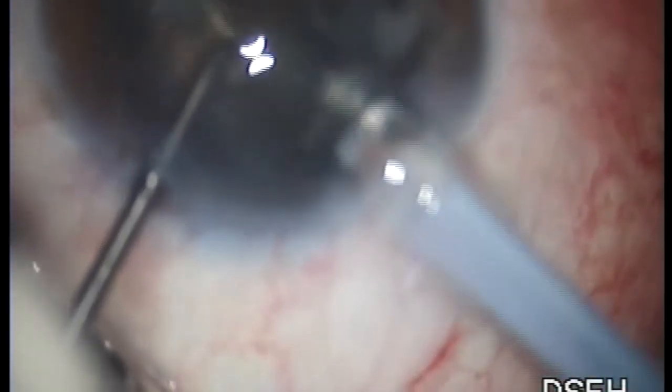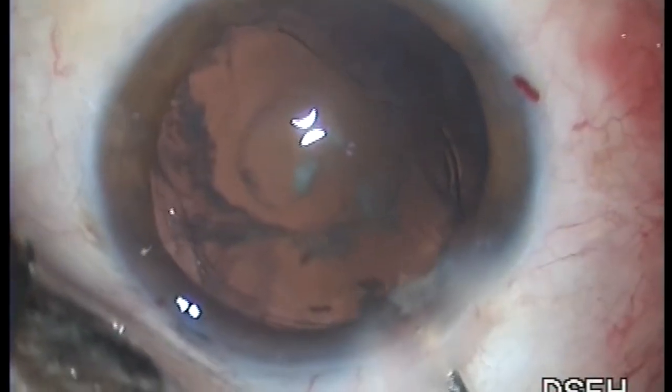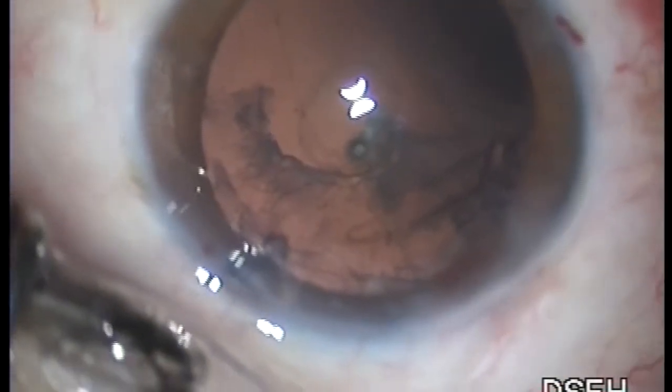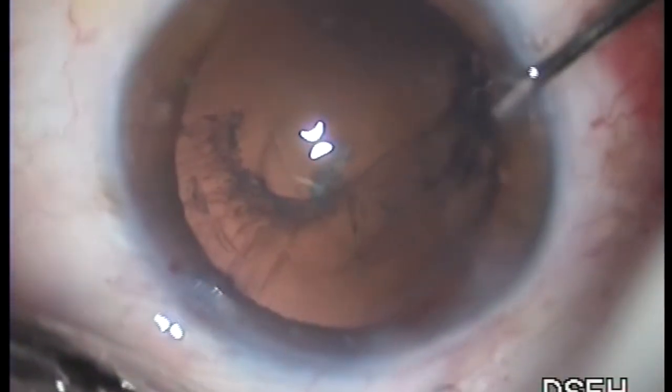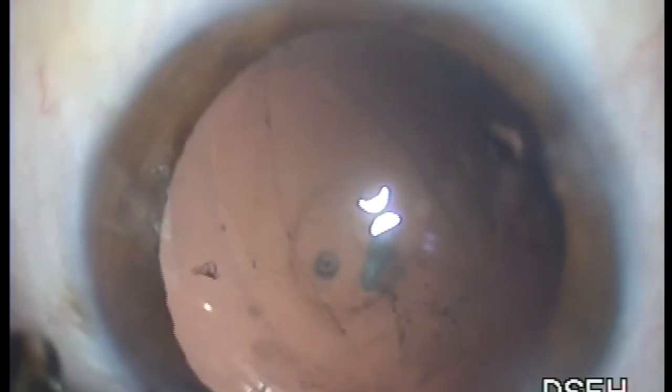Phacoemulsification is started as usual. The long oval capsular axis prevents the rise of fluid pressure in the capsular bag and prevents the dislocation of the nucleus into the vitreous. Very carefully, the lens matter is being withdrawn.